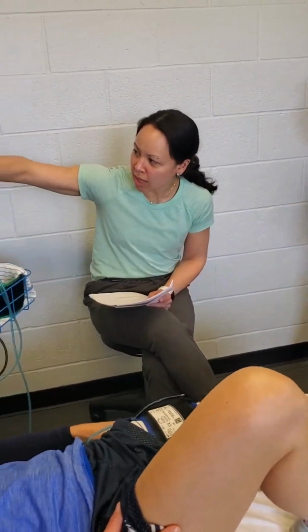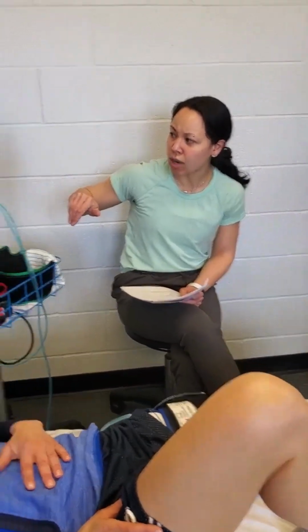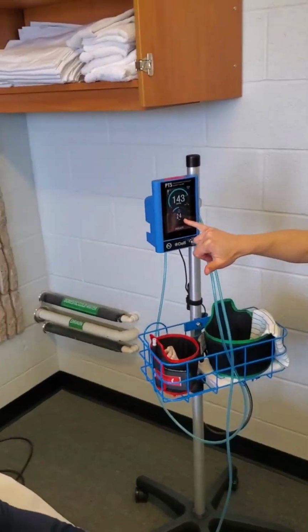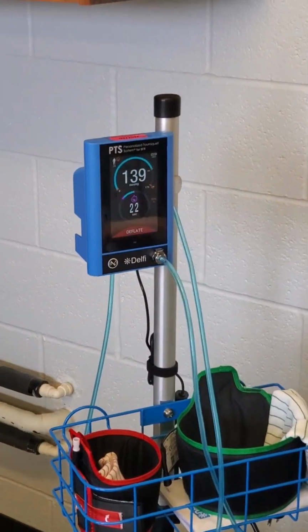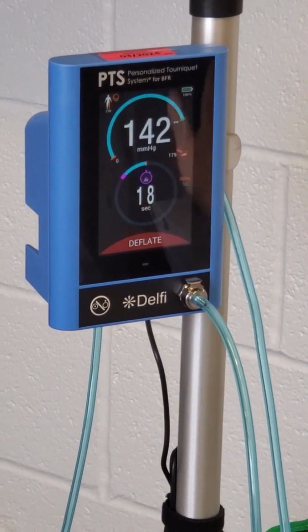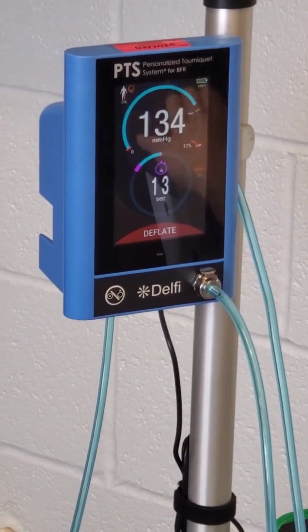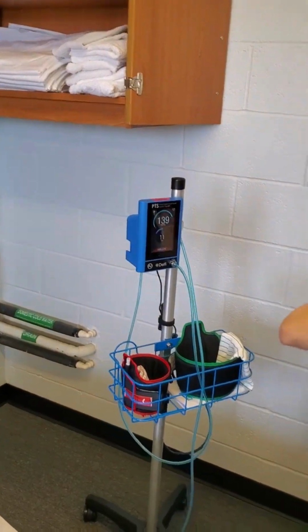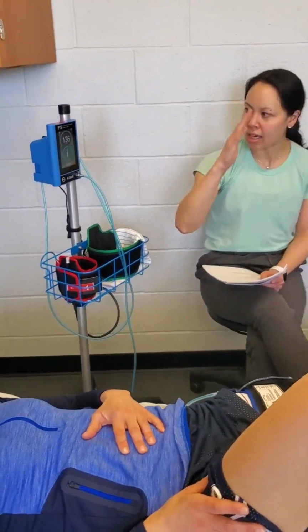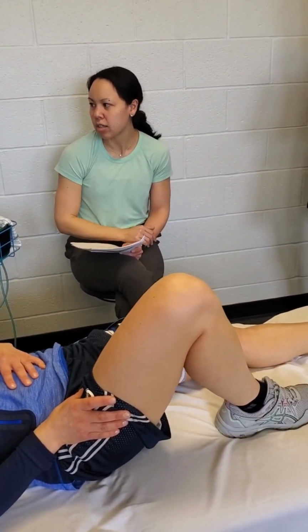Then here you hit the little clock, the rest. That's her 30 seconds of rest, and it counts down on the bottom circle here. The really nice thing about this system, and why it's so much money, is you could see, as Kendall was doing her leg lifts, the pressure changes. It fluctuates, but that's because she's moving. It's really nice because it shows you that it's maintaining where we want it to be. Okay, so 5 more seconds.